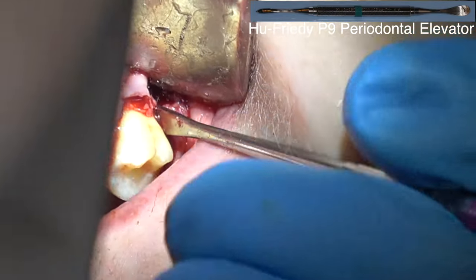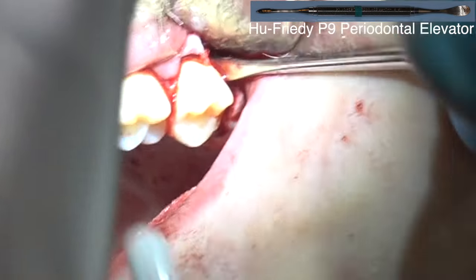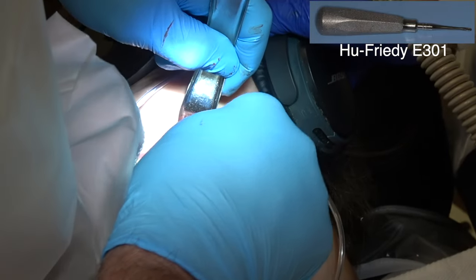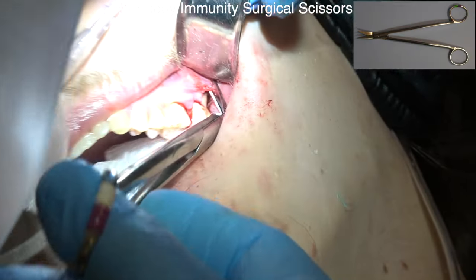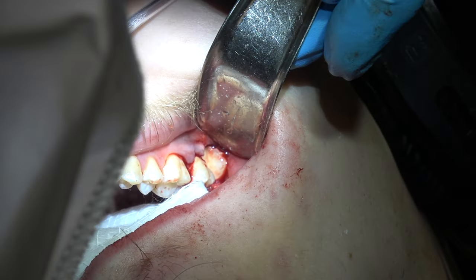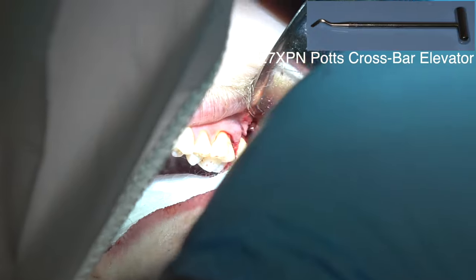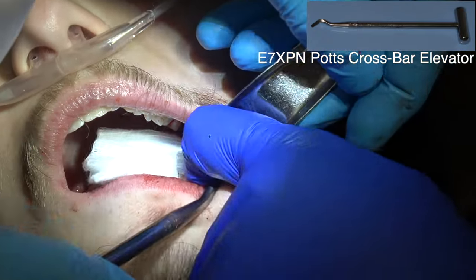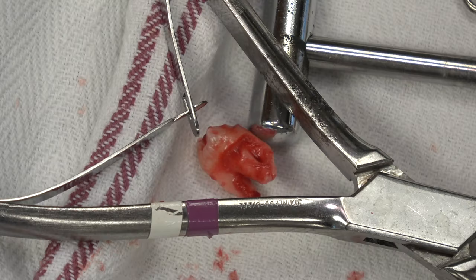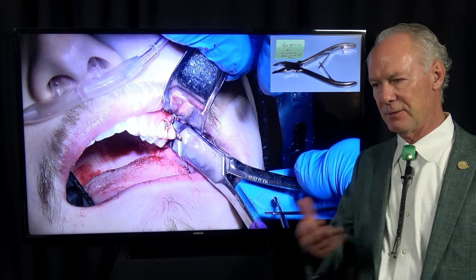This is the periodontal elevator. Then I'm using the 301 trying to go up and out. Be sure you've got a 2x2 in the mouth in case that tooth just pops out so the patient won't aspirate it. Here it comes — finally. You see the roots are fully formed and they're dilacerated, and that's just a big mass to be elevating.